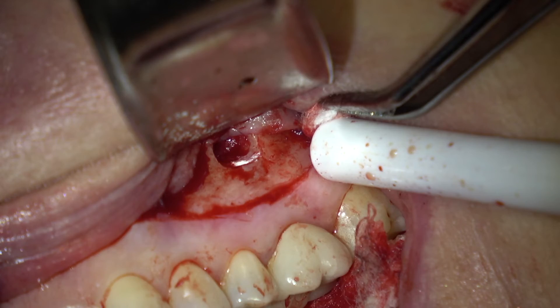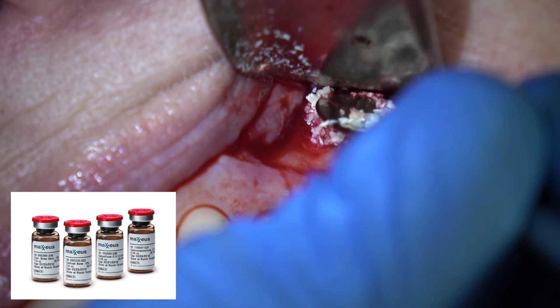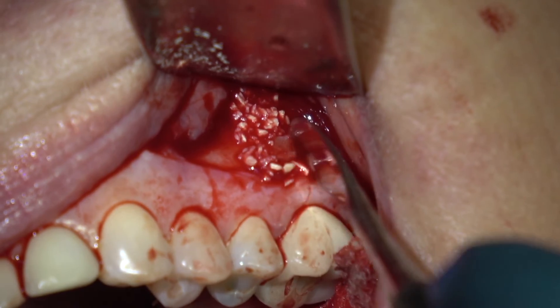Then we're going to bone graft this with freeze-dried bone — this is Maxius freeze-dried bone, I like that material very well. You can also use BioOss, which is another good material.